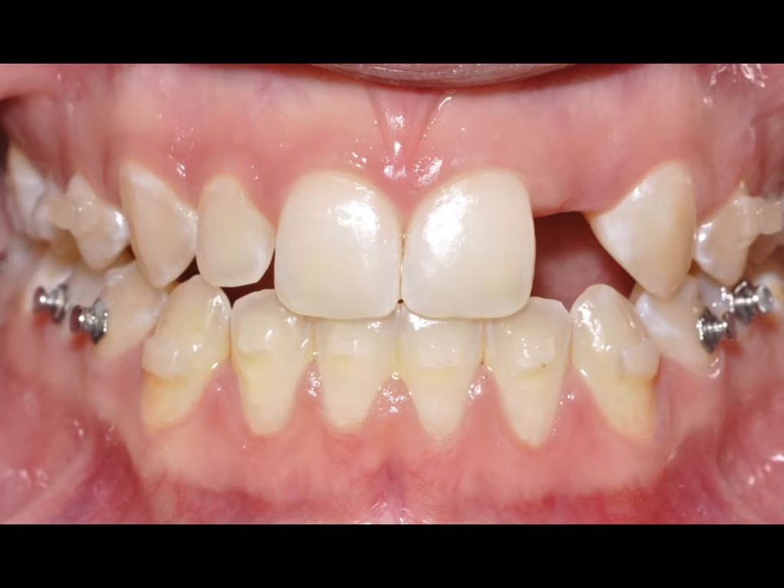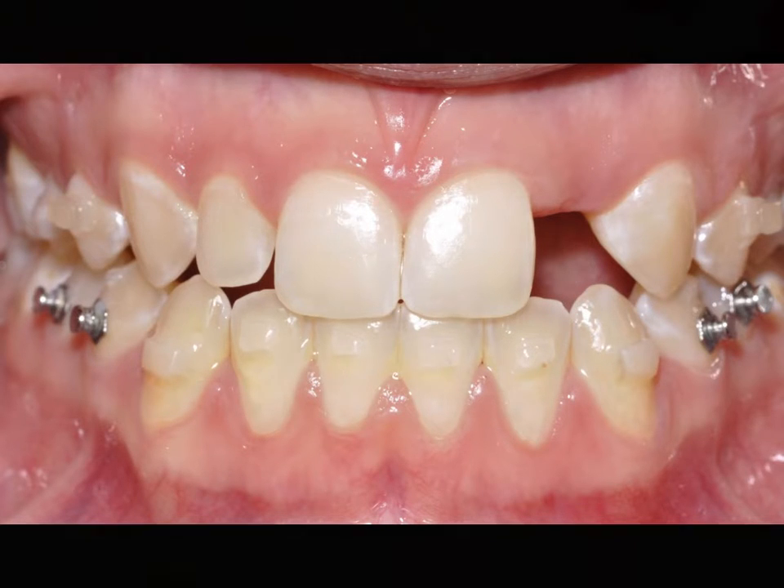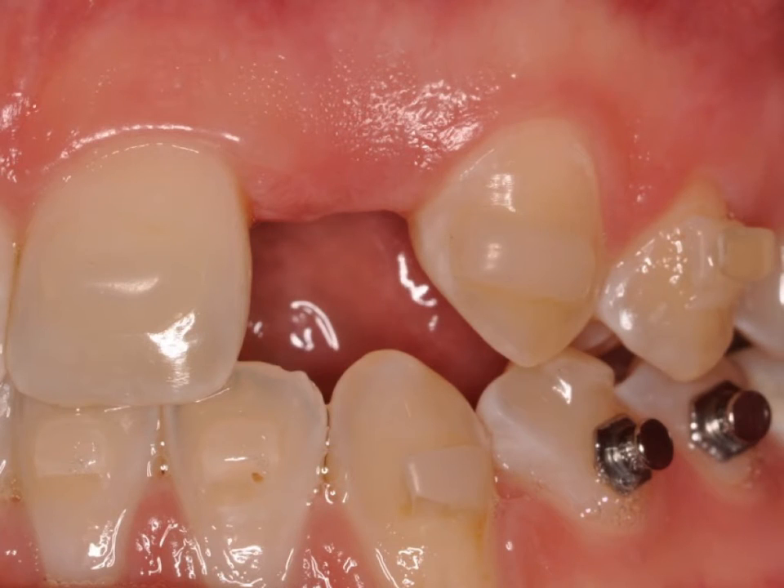This is a preoperative view of the patient's retracted anterior dentition. You can see the Invisalign attachments in position. This is a close-up view of the surgical site and you can see the concave nature of the region number 10, which is the region of the congenitally missing tooth as I mentioned previously.